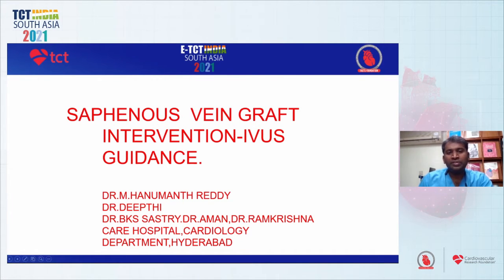Today, we are going to discuss saphenous vein graft intervention under IVUS guidance. We are discussing this case from Care Hospital, Hyderabad.